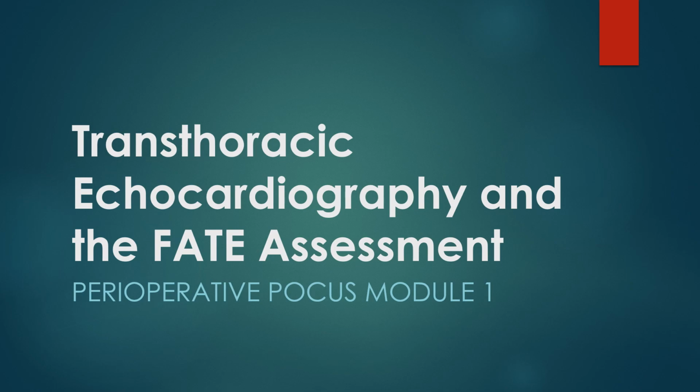The FATE exam is an abbreviated protocol for the full transthoracic echo protocol and is an effective supplementary tool to physical examination and intuitive thought. It offers a very systematic and focused approach to the echocardiographic examination and proposes a skill set that can be very readily and quickly learned.